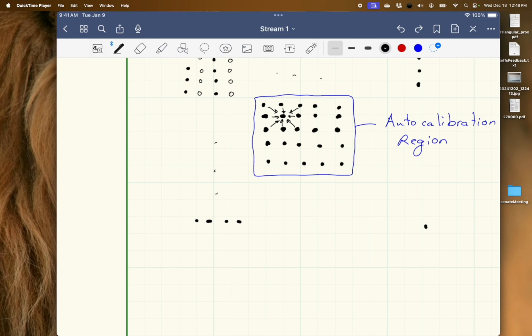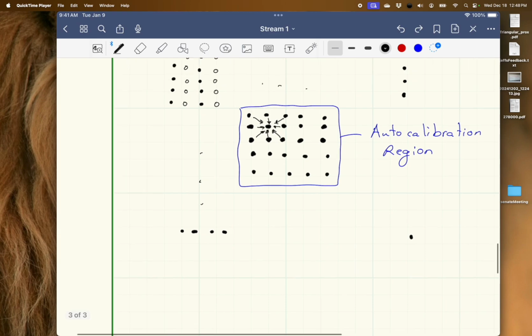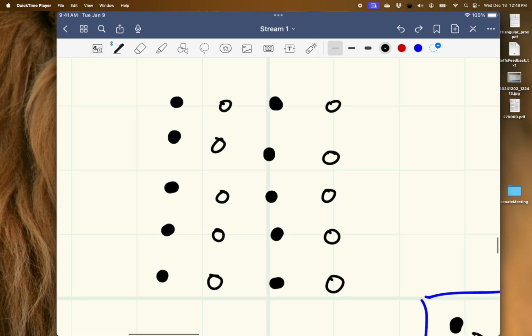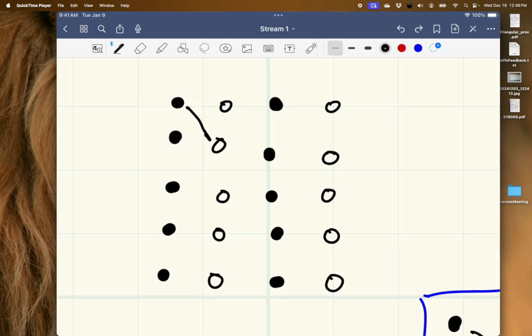SPIRiT extends the GRAPPA approach. And the difference is, I'm going to zoom into these points now. SPIRiT's going to assume we collect all nearby values.